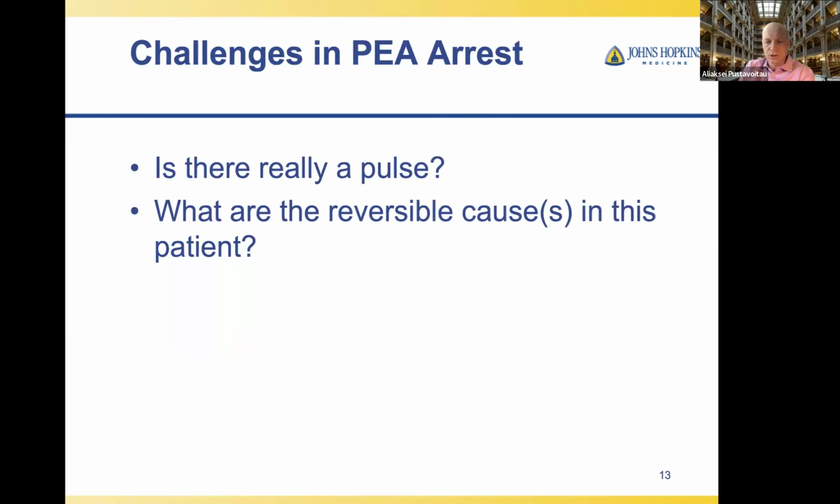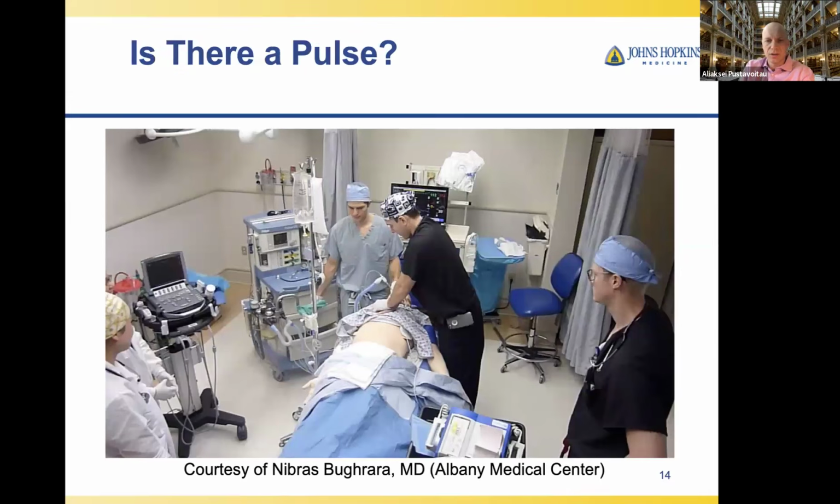Now, shifting to the PEA, or pulseless electrical activity arrest, there are two main questions. Is there really a pulse, right? It's always a problem. And what are the reversible causes in this patient? So let's see, a quick note about the pulse.